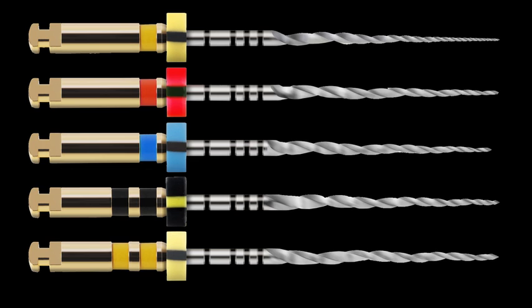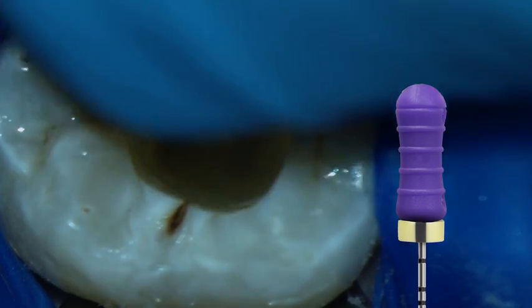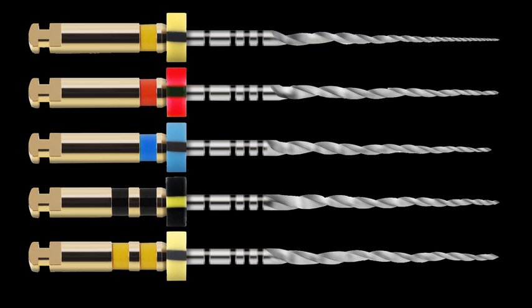As with most endodontic instrument sequences, the use of ProTaper Next is preceded by the establishment of the working length and a glide path. This highly edited video already shows a case which has been negotiated with a number 10 hand file. The working length has also been established. A good glide path is necessary with the ProTaper Next sequence, just like any other system you've used in the past. Most canals can be prepared with just 2 of the ProTaper Next instruments.